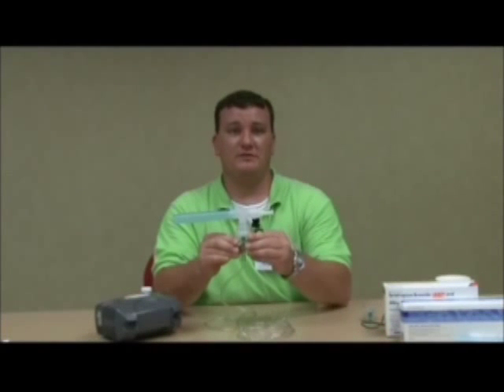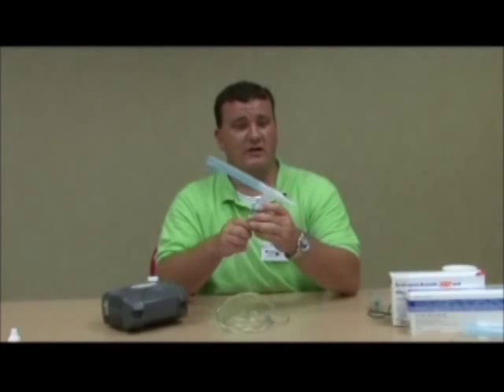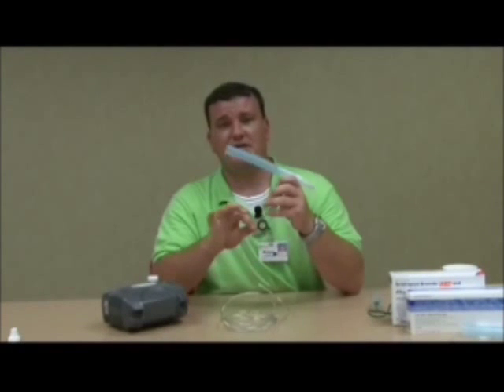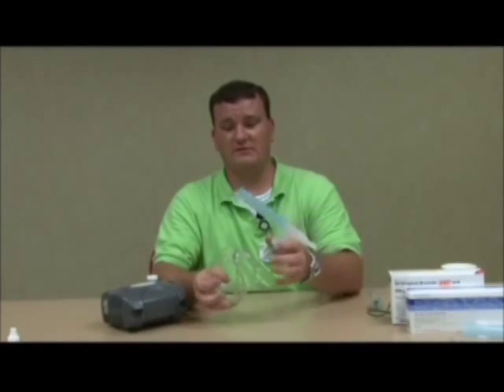It's very important that you make sure that you throw away and dispose of your nebulizer kit at least every 30 days and get a new one. Over time, the tubing, if you're not replacing it, can cause bacteria and things to grow into it, which we do not want you to inhale. It's very dangerous.